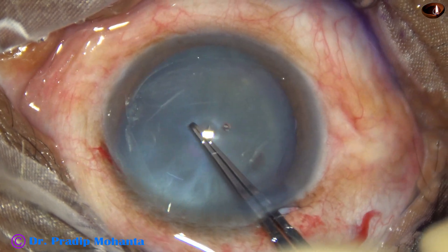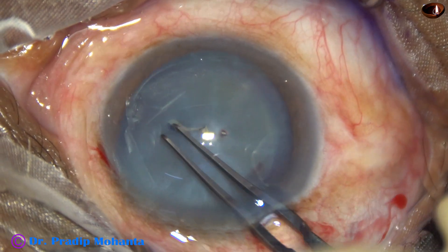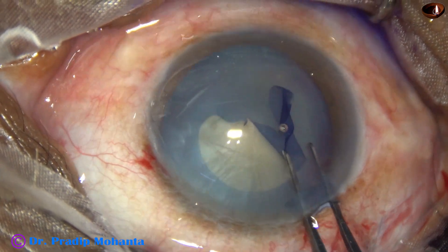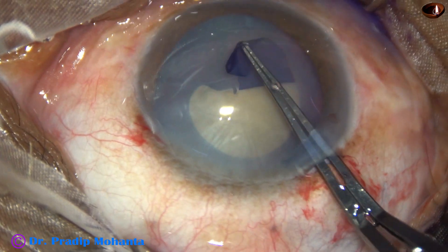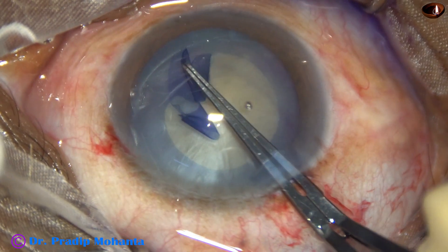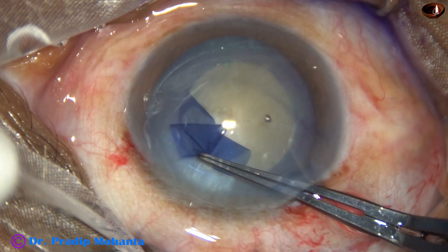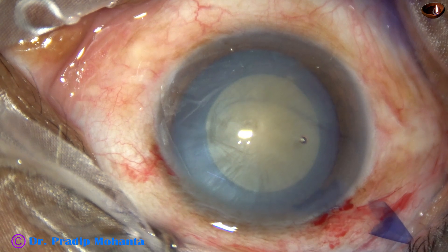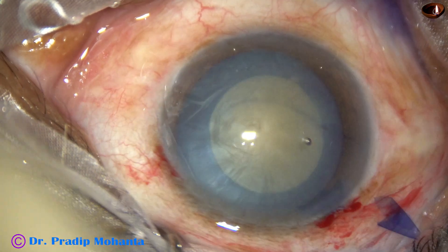Now I am using a Utrata forceps to do capsulorhexis. A capsular tag is raised by the tip of the instrument. The tag is guided anti-clockwise and an optimum-sized rhexis of about 5.25 millimeters is obtained.